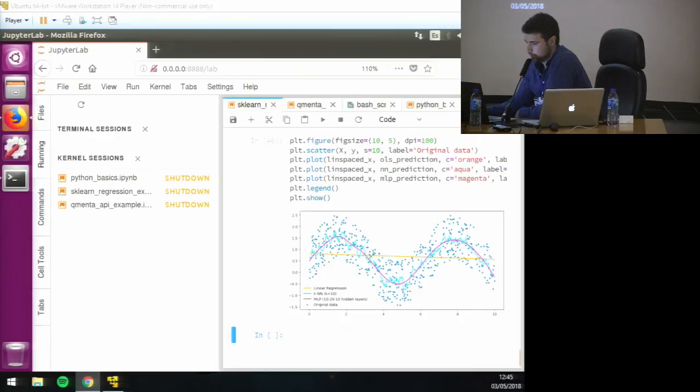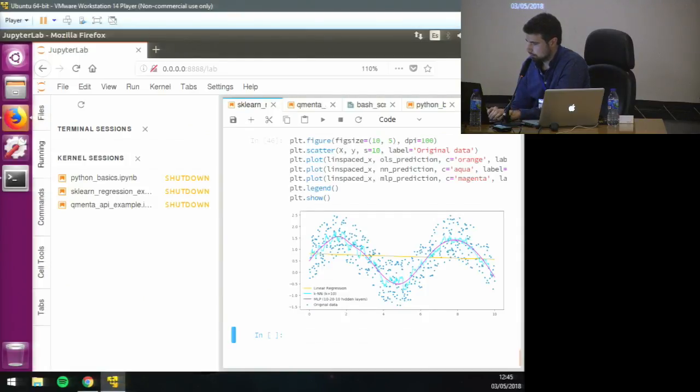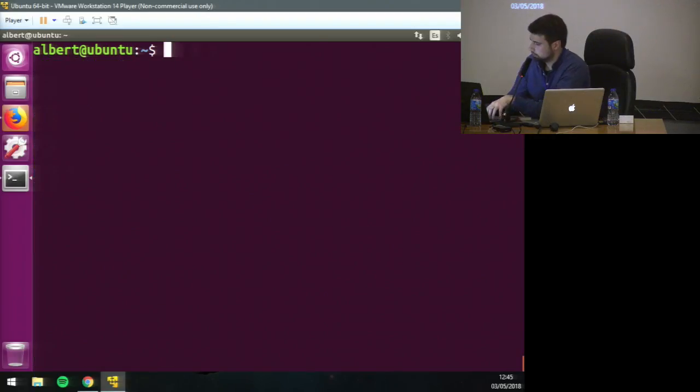Okay. Since we are running out of time, my plan was to make you do some exercise now, but we'll skip that and we'll just focus on how I actually work with the SDK, our SDK, to implement the tool. The idea is very simple. This model, or this function that you will find that gets some data from the patient and outputs the age, will be a function that you can just input to a Python script that is ready to run.